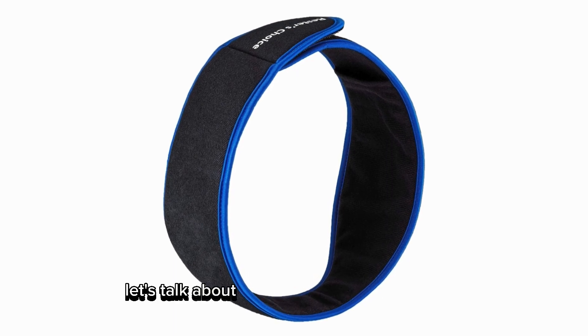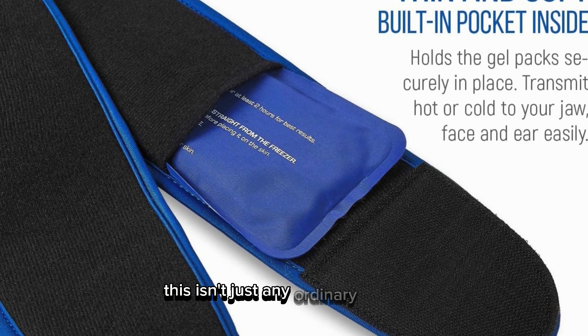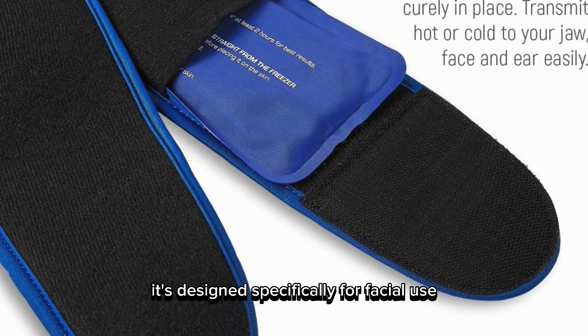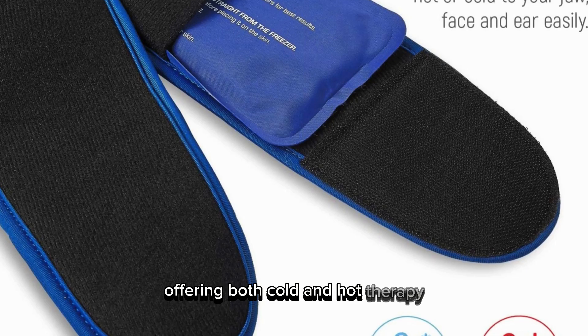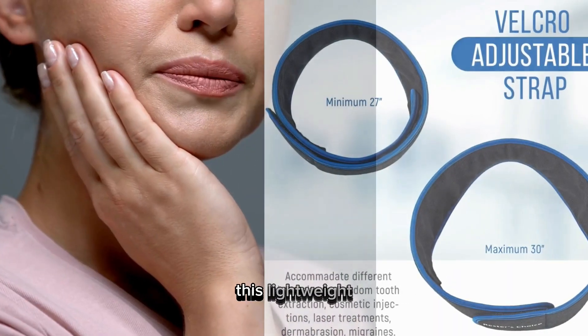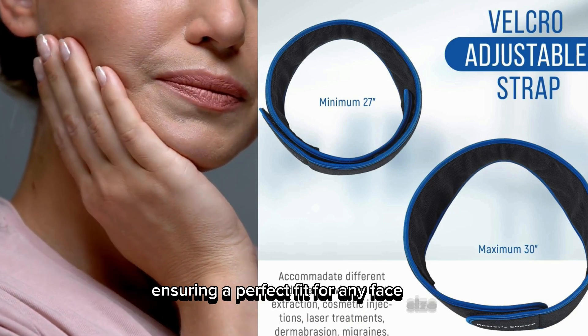First off, let's talk about what this ice pack is all about. This isn't just any ordinary ice pack. It's designed specifically for facial use, offering both cold and hot therapy. Perfect for adults and kids alike, this lightweight, reusable ice pack comes with an adjustable strap, ensuring a perfect fit for any face size.